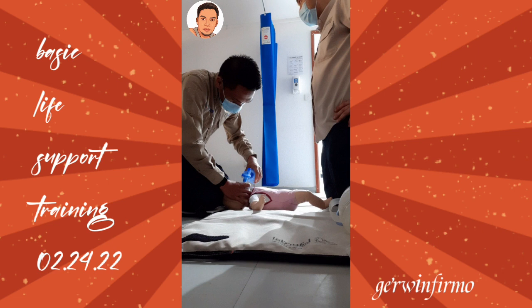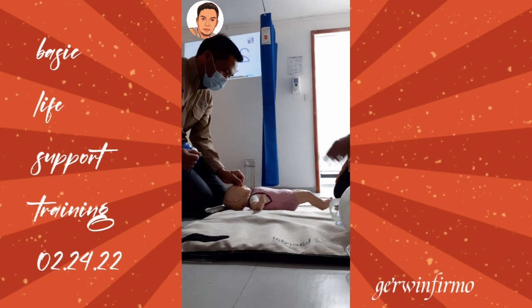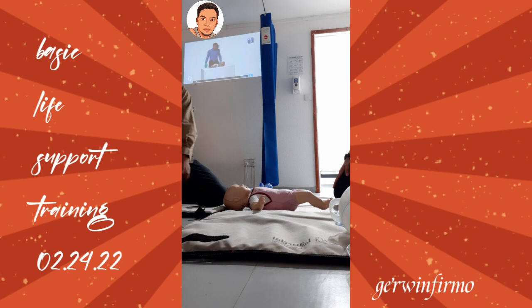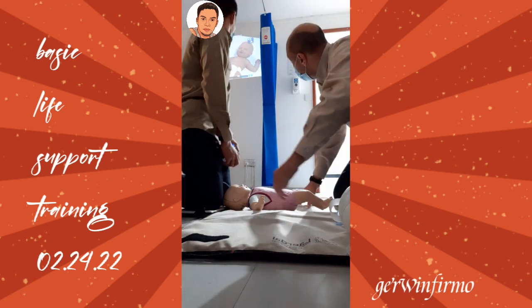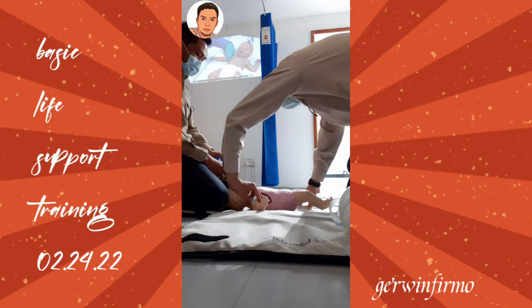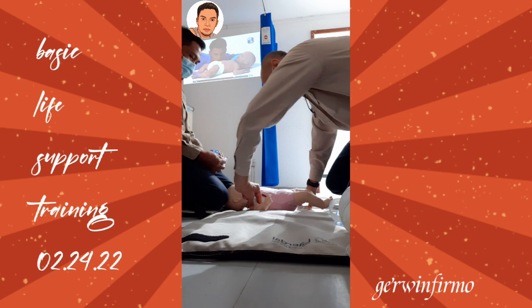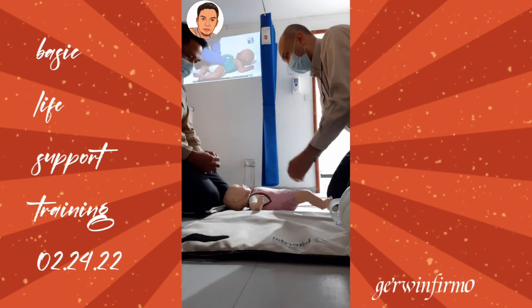If you want to practice more, do it. Times 2, 10 seconds. Here we go in 3, 2, 1. Check breathing. Check pulse. Hey, are you okay? Are you okay? 1, 2, 3, 4, 5. No pulse, no breathing. Activate the emergency response and get an AED. There is no breathing and no pulse.